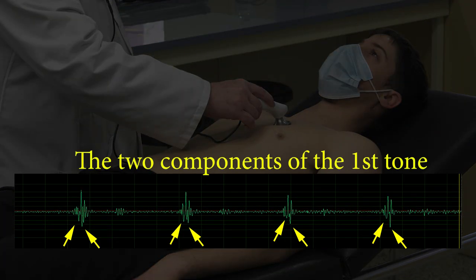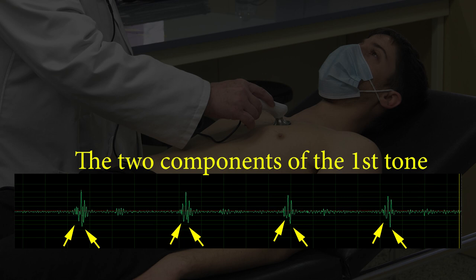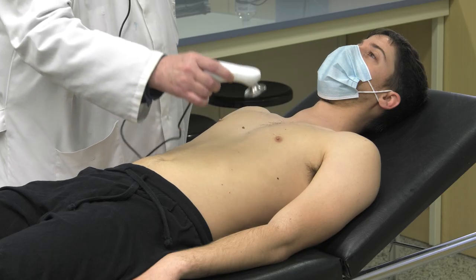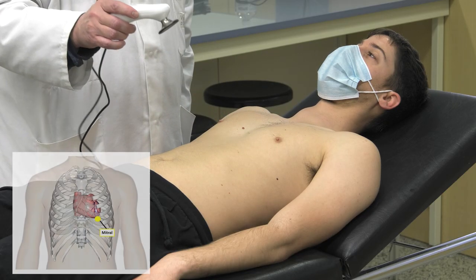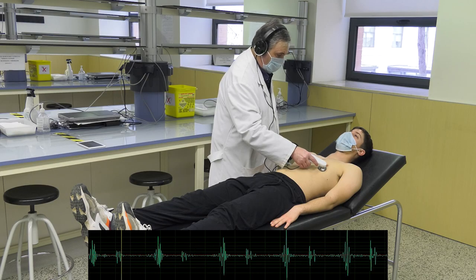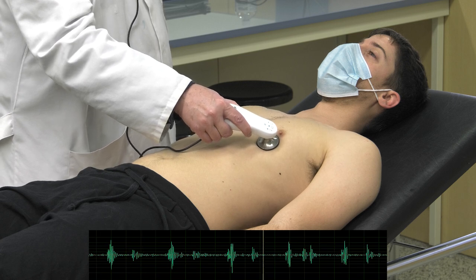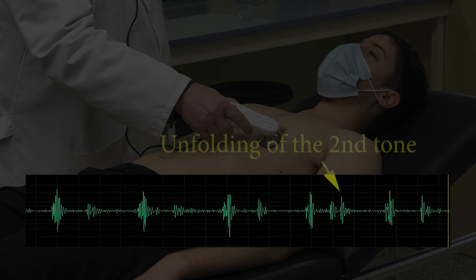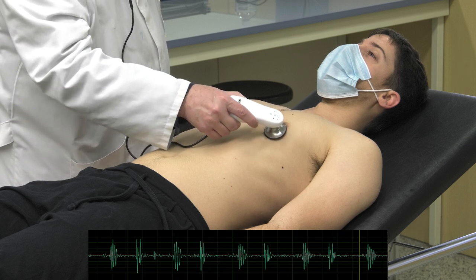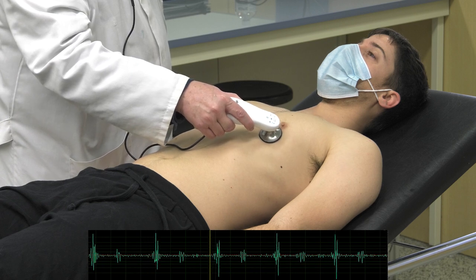The two peaks of the recording corresponding to the first heart sound show the two components — mitral and tricuspid — of the sound. The doubling of the second tone is audible, but not that of the first tone, since it is much more difficult to occur in physiological processes.